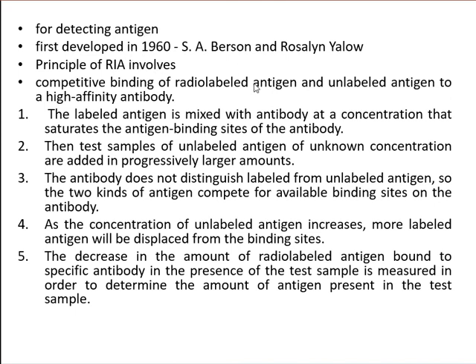This technique was first developed in 1960 by S.A. Berson and Rosalyn Yalow. The principle involves the competitive binding of radio-labeled antigen in your kit and unlabeled antigen in your sample. So, what are they competing for? They are competing for a high affinity primary antibody.